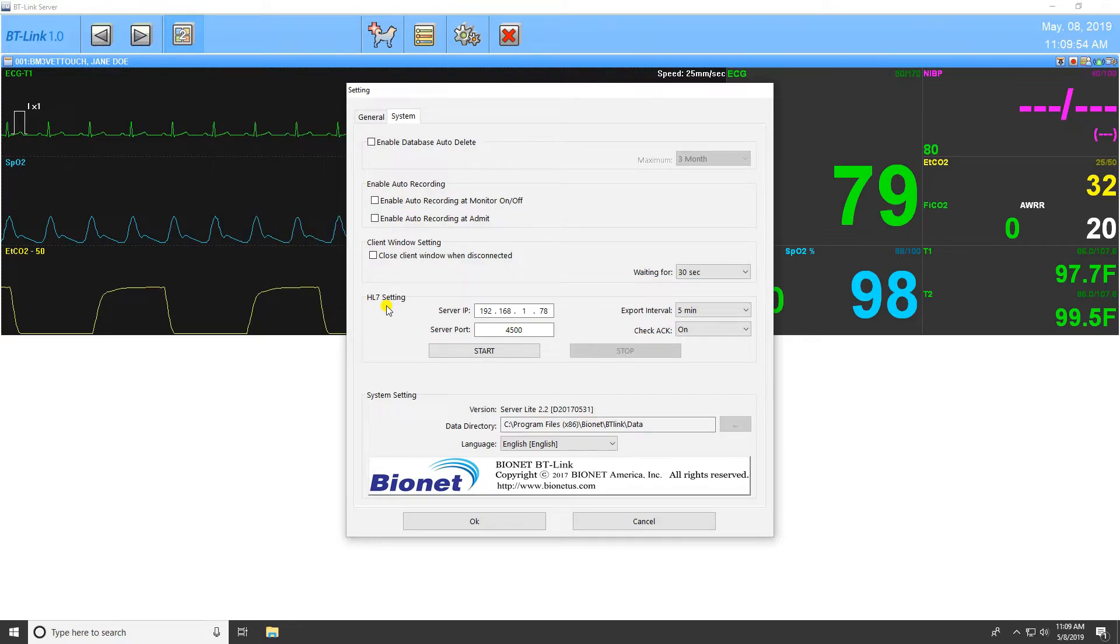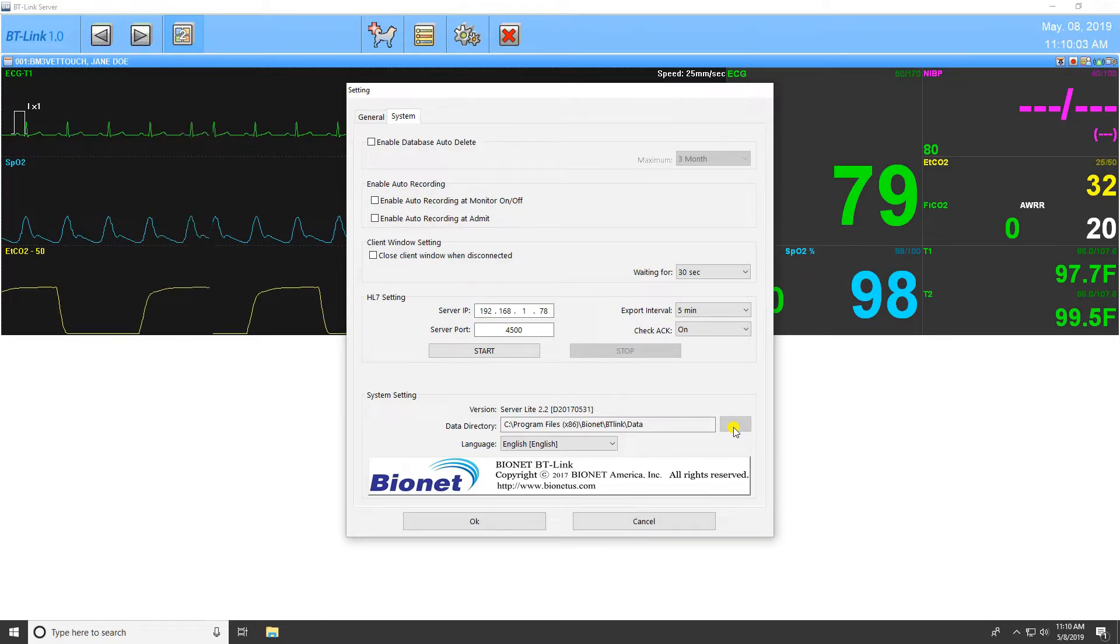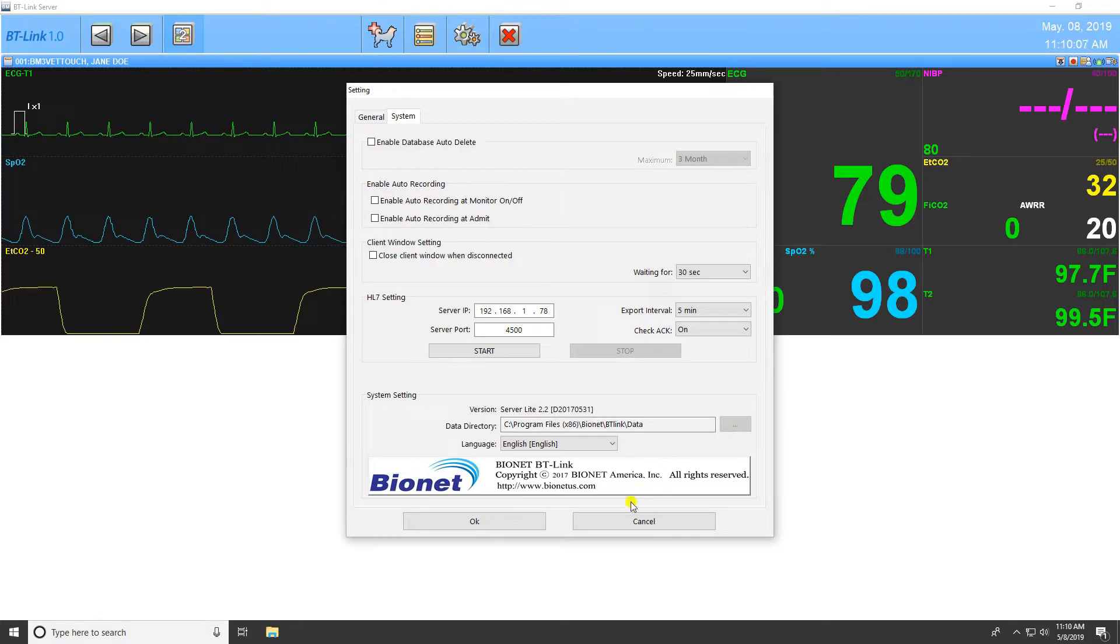You must also determine if your server requires an acknowledgement message confirmation. The final setting on this page is to set the file path destination for patient data and what language the program will be displayed in. The current version of the program is displayed above these settings.